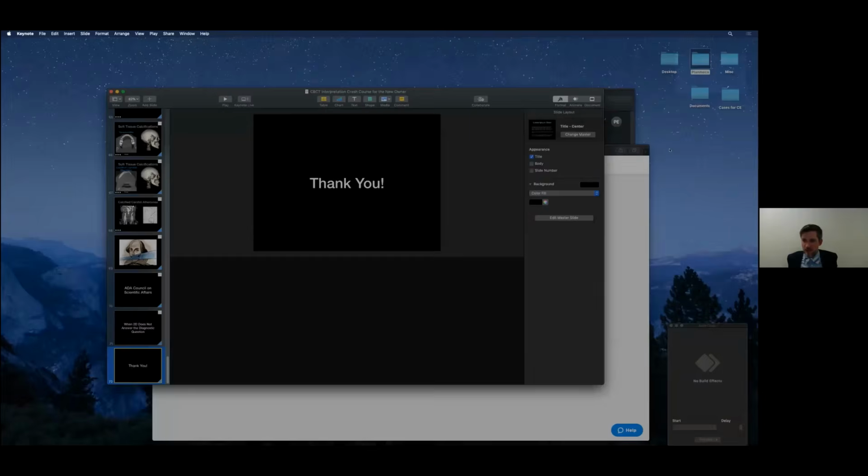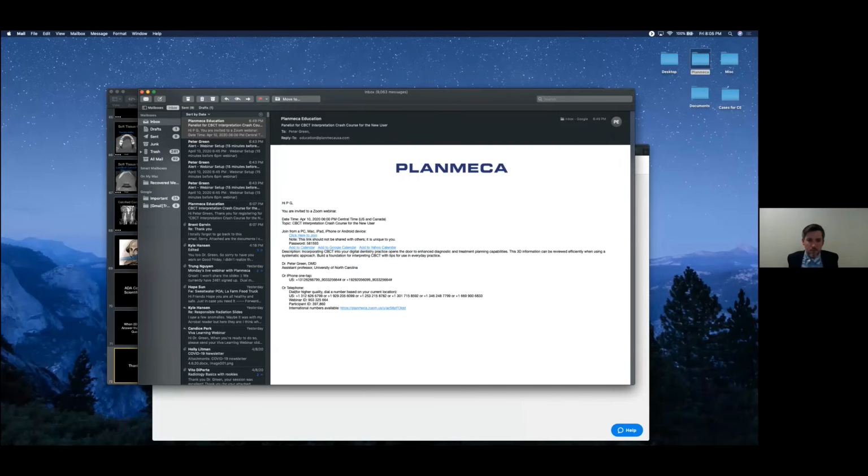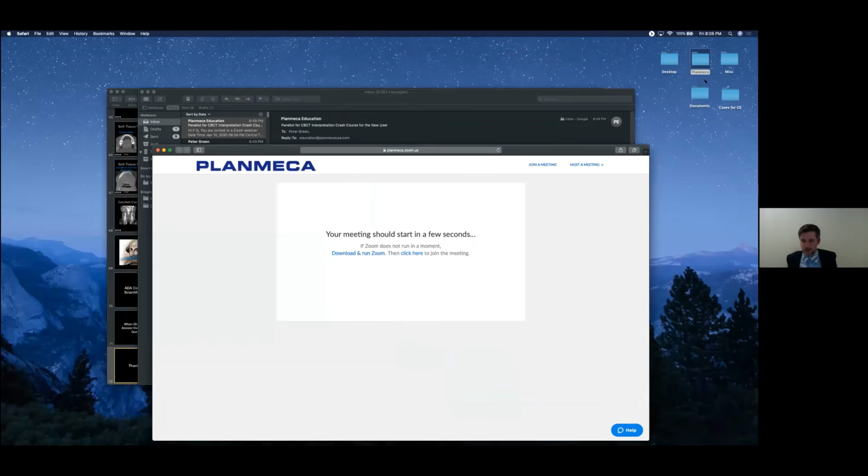And I think that you answered this one, but what are the guidelines regarding doing a CBCT on every new patient in the practice? Okay, so I don't see the Q&A. Okay, no worries. I'll do my best. Yeah, I think I've got it, actually. Okay. Let's see. Yeah, I see the Q&A section.